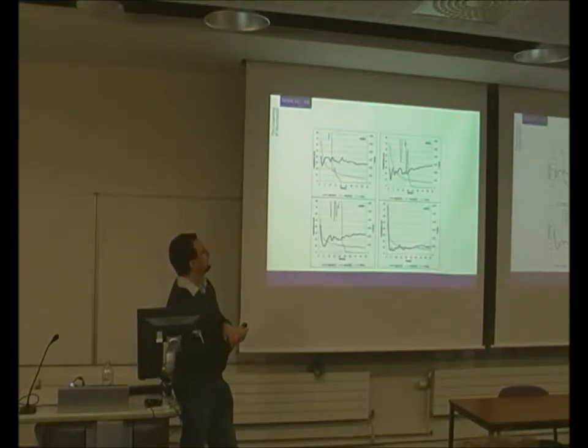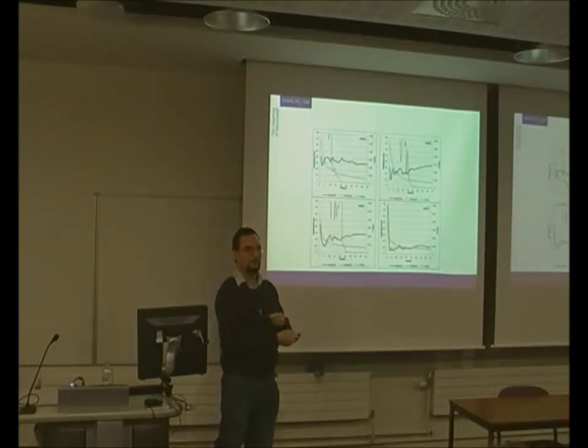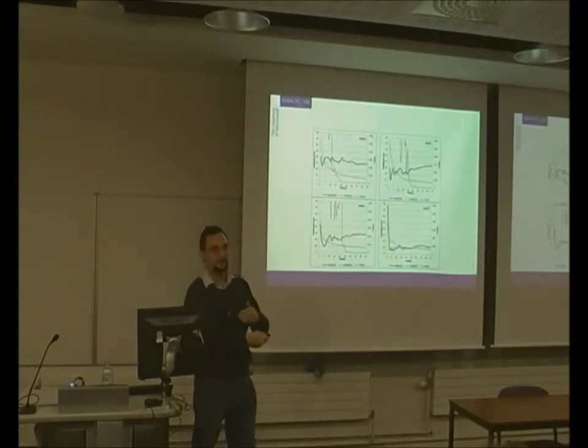So in this recording, if we were using the 2% criteria, it took about 15 sweeps to reach significance. But down here, it never reaches significance at 10 dBHL, so the threshold would have been taken as 20 for this subject. But that depends on test time, because after 15 sweeps here, we didn't have a response at 20 significant, but after 25 sweeps, we did. So you can already see that as you increase the recording time, you end up with a slightly lower threshold.